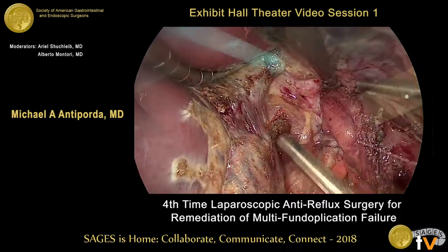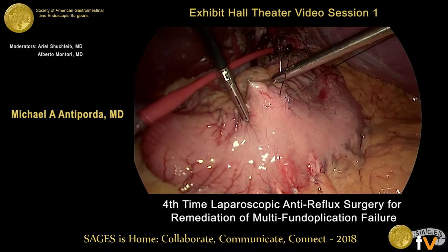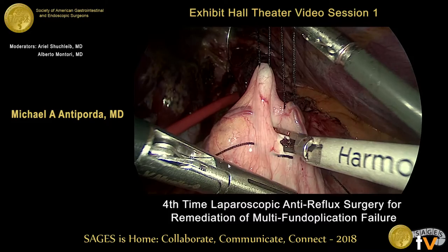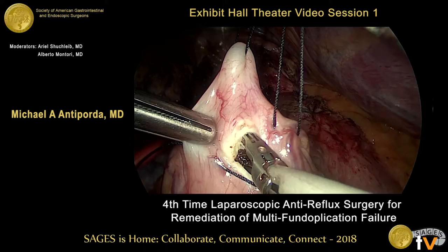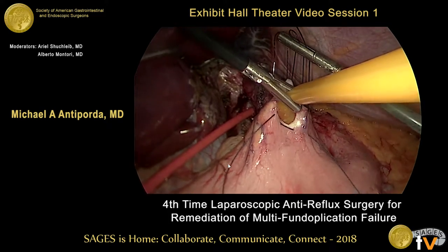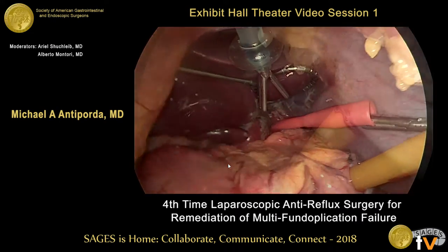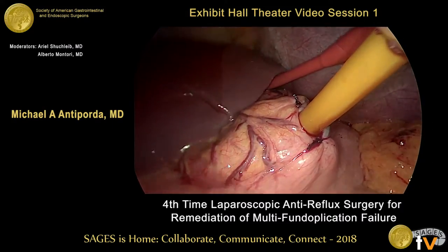Once our final stitch is completed, we remove the Penrose drain. Due to the recurrent nature of the patient's fundoplication failure, we felt that he would benefit from some gastropexy and also to assess any possible delayed gastric emptying after manipulation of his GE junction, so a gastrostomy tube is placed. A 20 French Foley catheter is used for this, and the edges of the gastrostomy are imbricated using zero silk. We then evacuate the capnothorax using the red rubber catheter and remove the liver retractor.